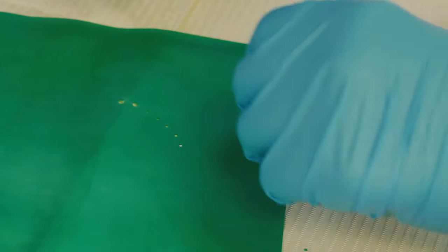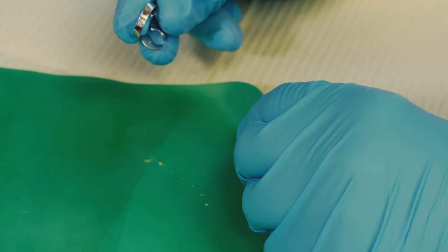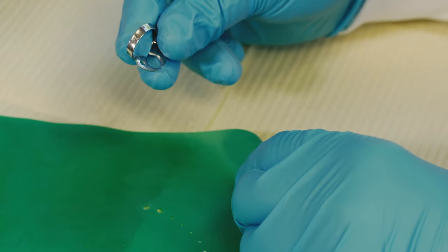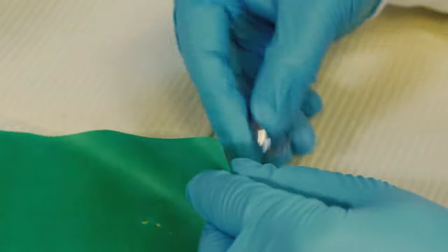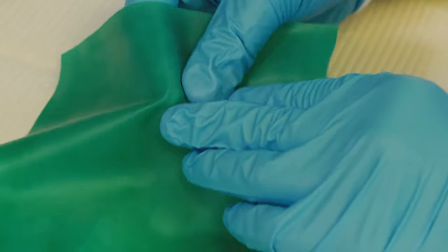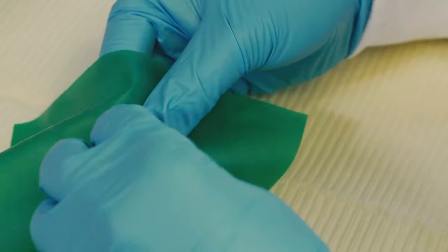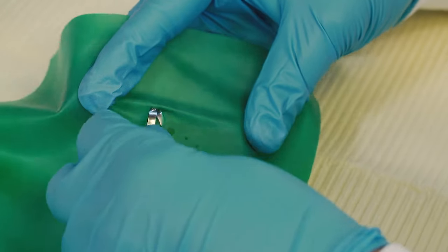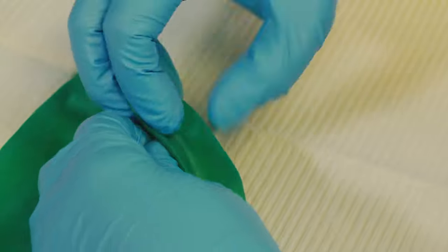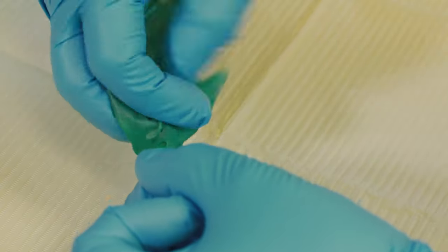A quick tip that I can give you is always attach the clamp to the rubber dam outside the patient's mouth. So what I normally do is I grab the clamp and I'm looking at the bow of the clamp. I put it underneath the rubber dam and I'm going to set it right into that hole that belongs to the retentive clamp, which is the W3 that I'm using right now. I make sure that the jaws of the clamp are centered with the holes and I'm ready now to take this clamp into the patient's mouth holding the rubber dam in this way so that we can protect our patient.